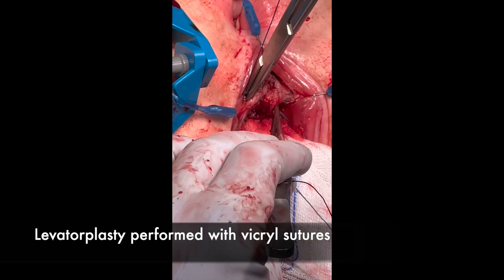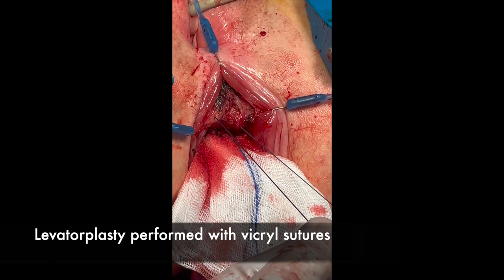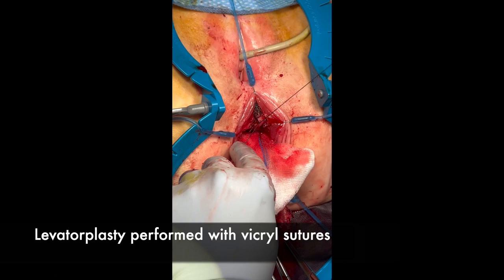Levatorplasty is generally performed to fulfill two purposes in this procedure. Firstly, it helps to reconstitute the anorectal angle. Secondly, it helps by adding bulk to the repair.